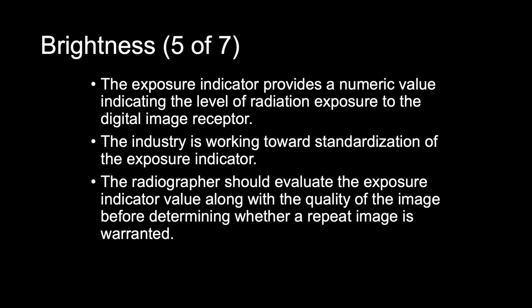A lot of our digital image processing will actually show the EI. It'll show it up as green if it's okay and if it's within range. If it's out of range, it'll show up as red. So then you'll know, if you look at the image and you see, not really sure if this is diagnostic quality, and then you look at the EI and it's in the red range, then you know that you probably need to repeat that image. So it'll be a diagnostic quality for the radiologist.